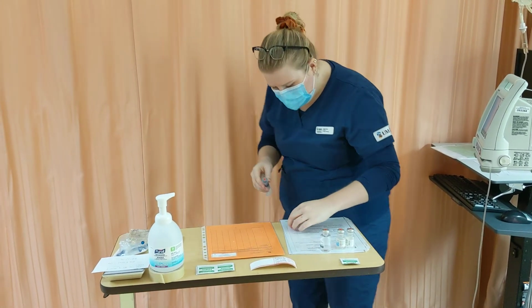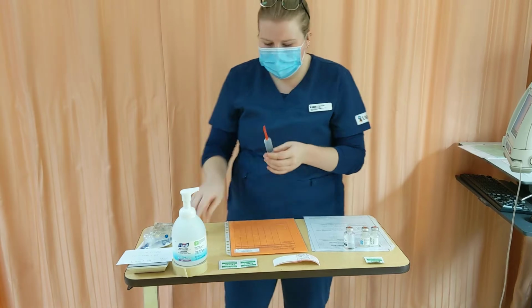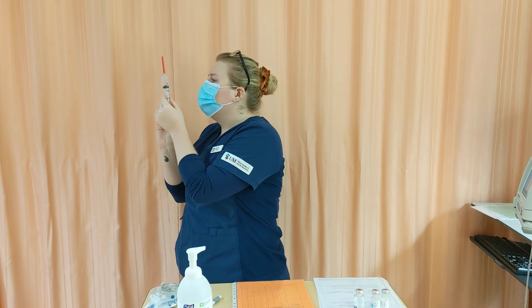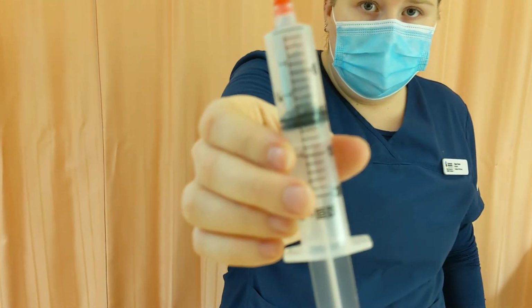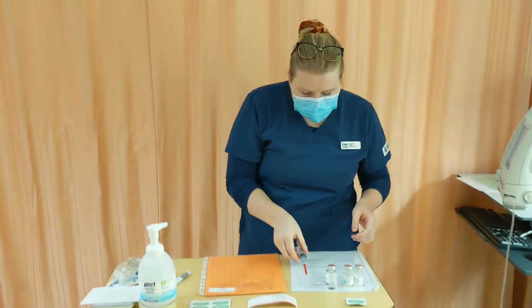After I've done that, I do my scoop method, so we're good. I'm going to knock out any bubbles, pull back, and do this over med waste. Okay, once I've got to 10 and we don't have any bubbles, I'm going to show the camera again. We have 10 mLs.